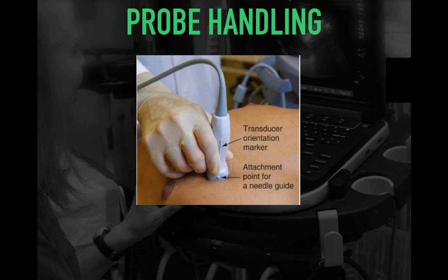The probe can be handled in many different ways. This is a common grip. This is called the pencil grip. But there are many ways, depending on which position you're in, which position the patient is in. I would encourage you to try different handholds that would allow you to maintain good anatomic posture and allow you to get in the right position.